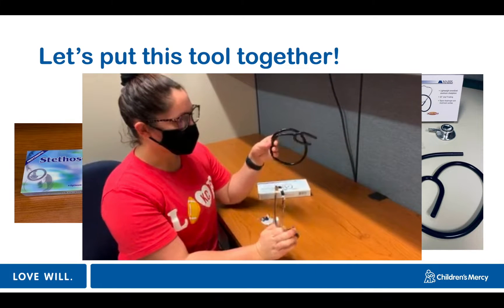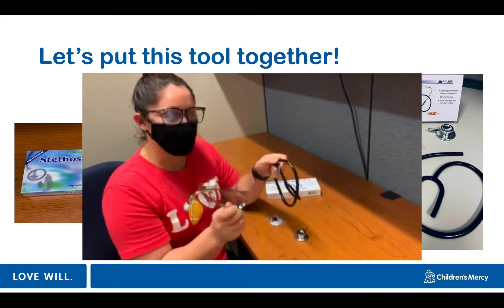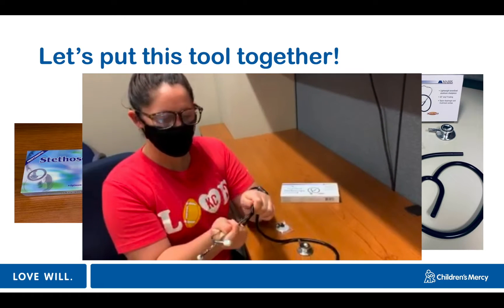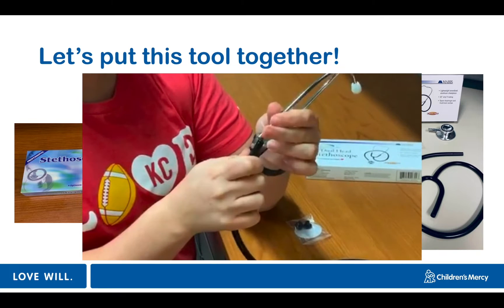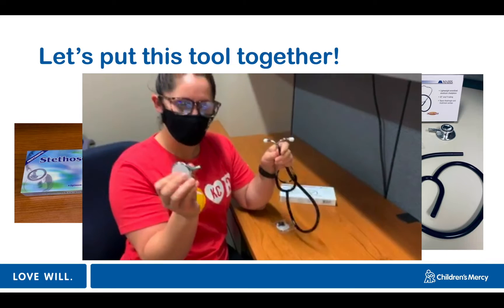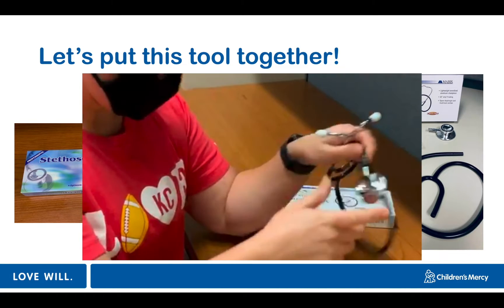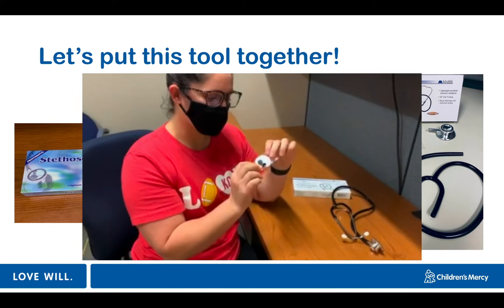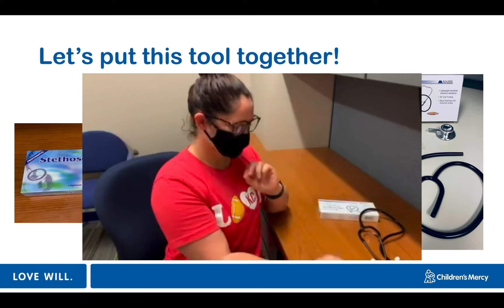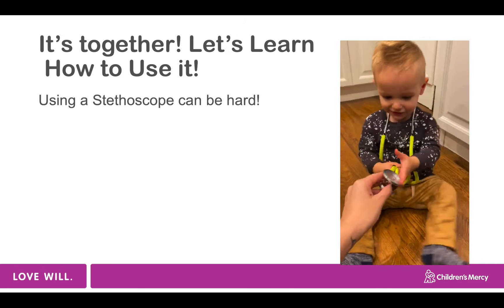These are the pieces of your stethoscope that will come in the box — they are not put together, so I'm going to teach you how. This is the chest piece and this is the tubing. They just go in there and you push them in as far as they'll go. Then you take the other end of the tubing, take your diaphragm and bow, and put it in there. Now that we have our stethoscope put together, let's learn how to use it.